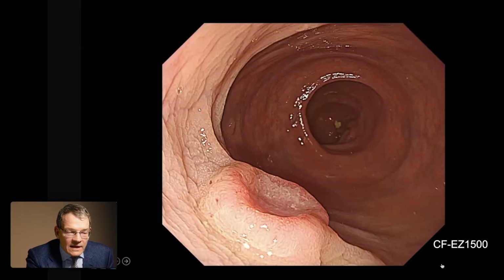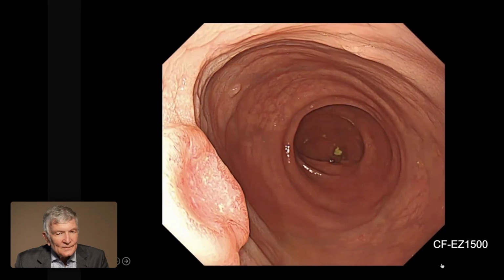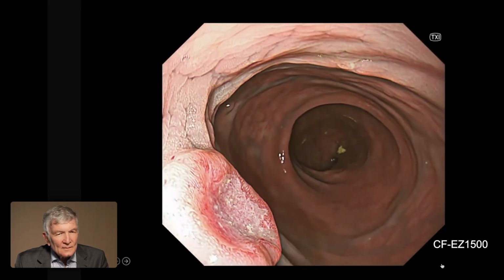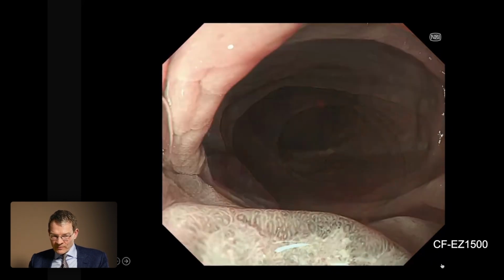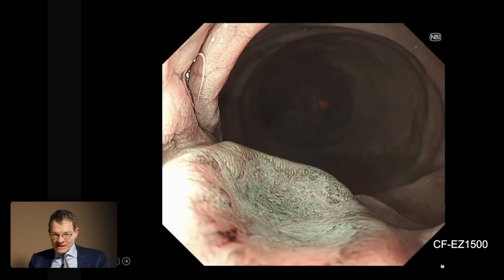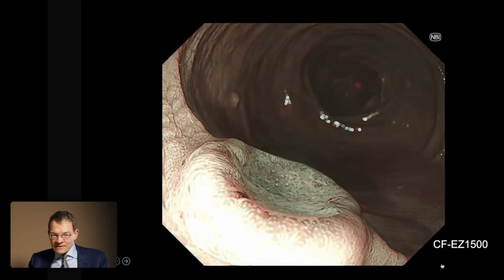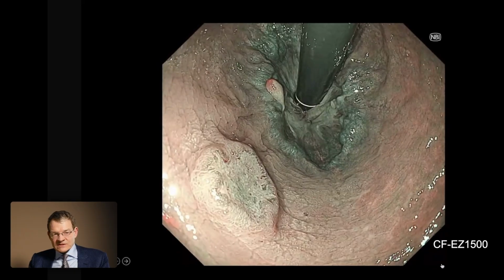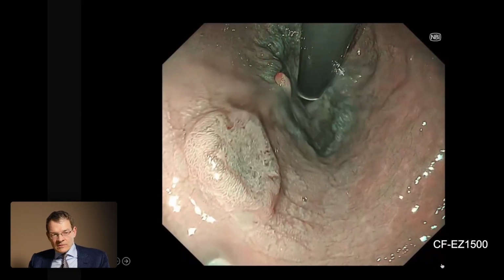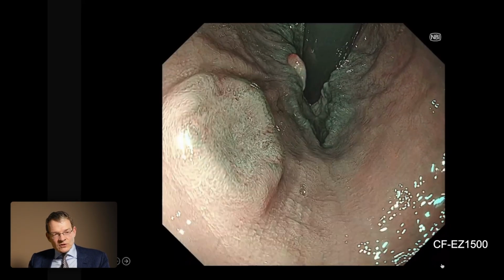Definitely, right? Yes. So here I would like to show you another case of the colon, also very interesting. It is only a 1 centimeter large lesion, and here you may also appreciate the new features of X1 technology. So this is TXI. You appreciate the structural abnormalities, and now we are using NBI, and you nicely appreciate these smaller glands in the center, and these structural abnormalities, and also these vascular abnormalities. And the problem in this case is that it is only 1 centimeter from the anal verge.